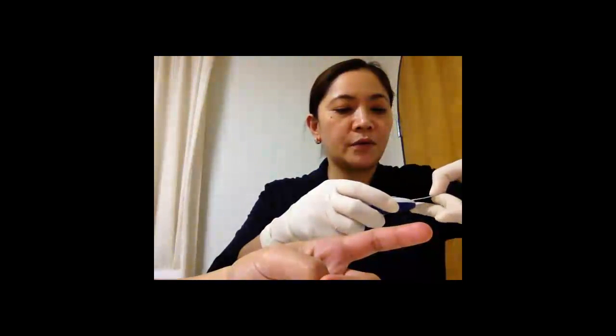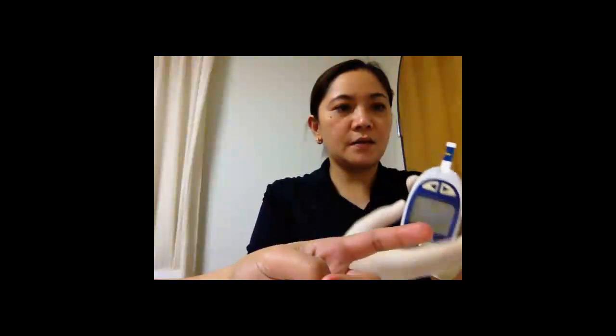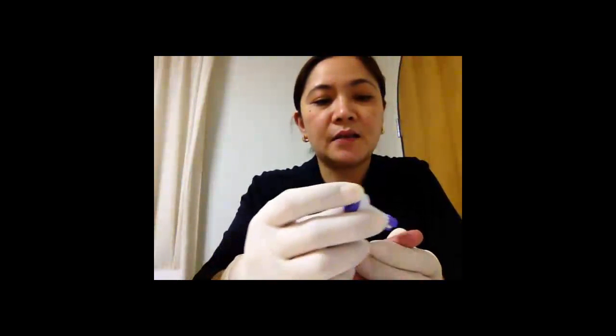Insert the glucose strip into the glucometer. Once it is inserted, there will be a signal that the glucometer is ready. Then get the lancet, hold the finger, and prick the lateral side of the finger.